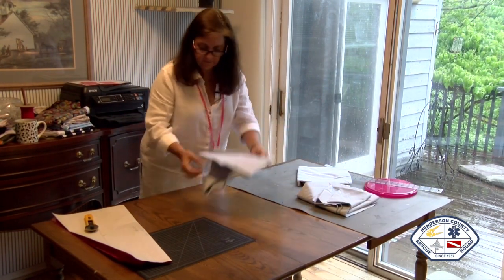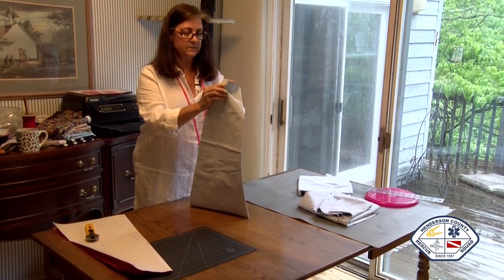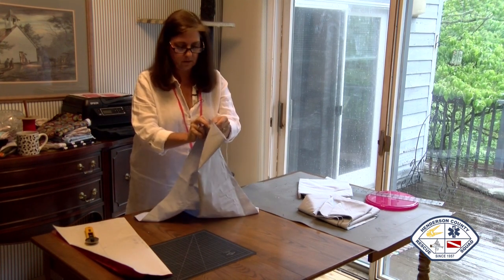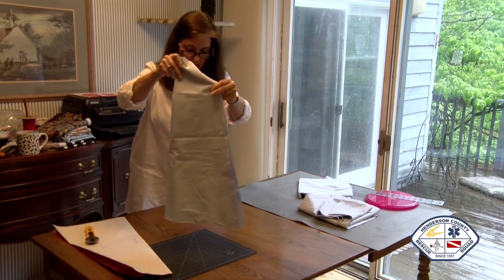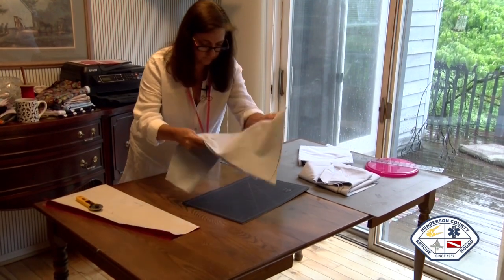So I have cut my sleeves. Obviously, you have to cut 2 of them. Now, let's put our curve on this one. I've already drawn it on.